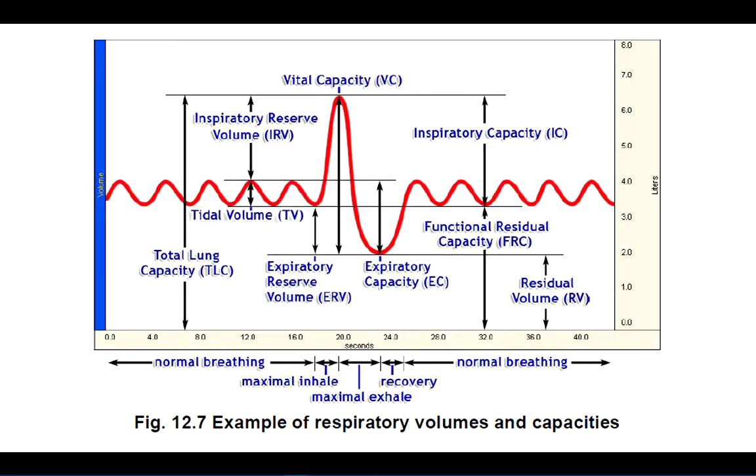And so when we further examine some of the changes that occur during our lung function test, you'll notice that we start a test with a series of normal breaths. Now, this series of normal breaths we're going to call tidal volume, and each of these upward strokes corresponds to an inhalation. A downward sweeping stroke corresponds to an exhalation. So this would be an inspire, an expire, an inspire, an expire. Now you'll notice there are a series of 5 breaths here. In and out, that's 1, 2, 3, 4, and 5.